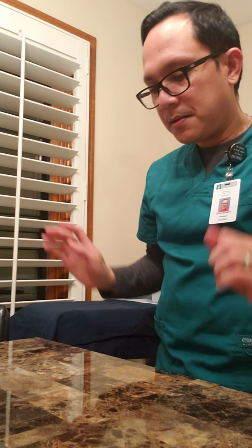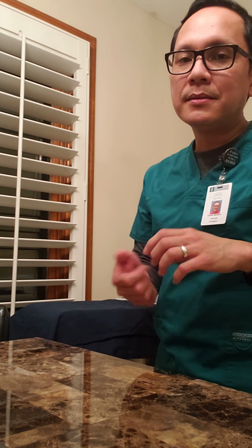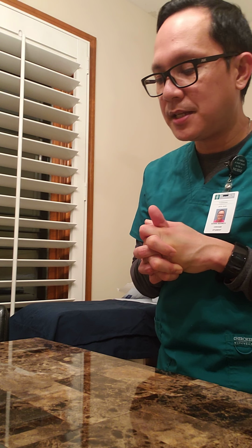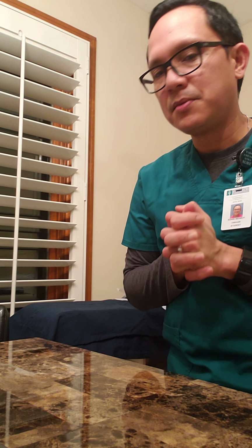And then you're gonna make sure you ask your patient if he's fine, how he tolerated the procedure, and if it's okay, then you can put him back in a safe position, bed all the way down, call button within reach. If he has any personal items that he wants by his side, you can give them to him as well. And you can ask him how he's feeling after the dressing change, so you will know how he tolerated the dressing change.